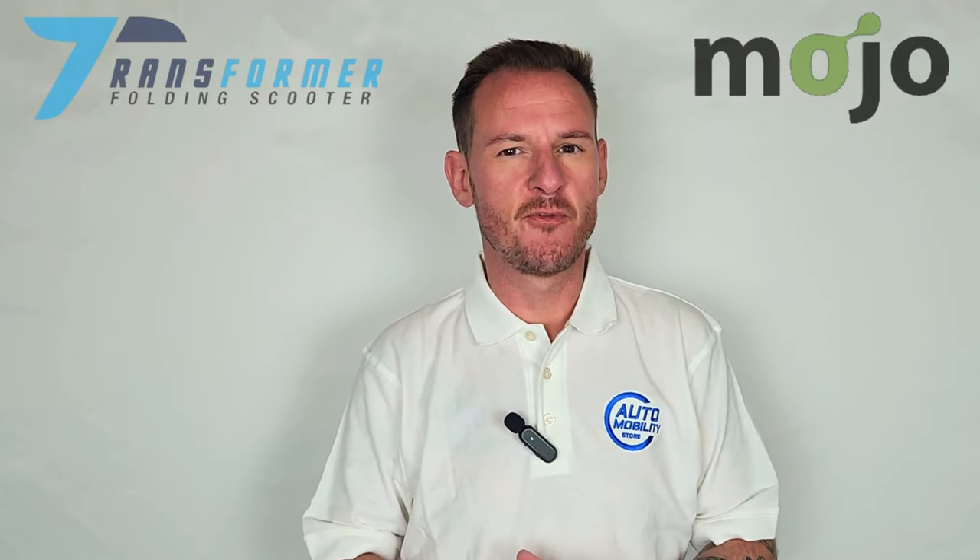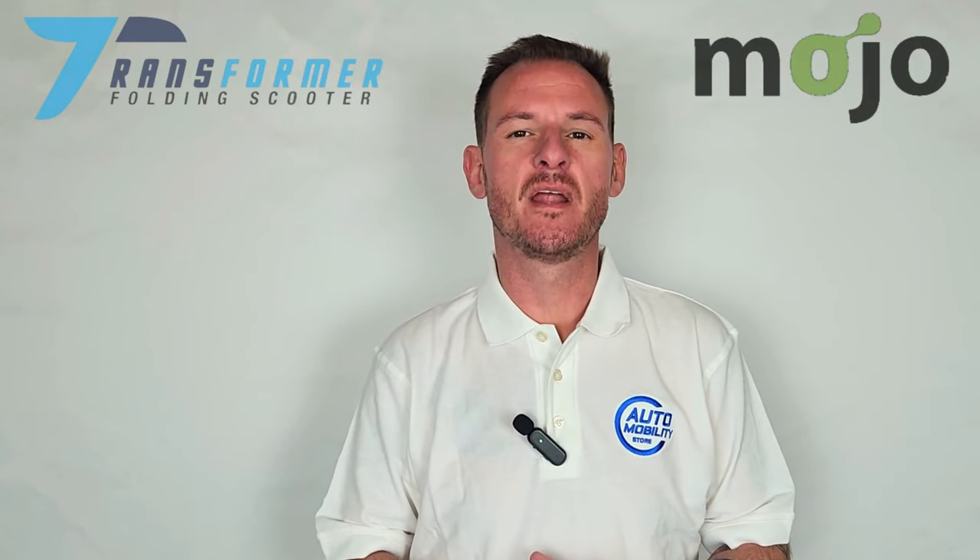Hello and welcome back to AutomobilityStore.com's YouTube channel. Today we're going to be comparing Enhanced Mobility's Transformer and Mojo automatic folding scooter.